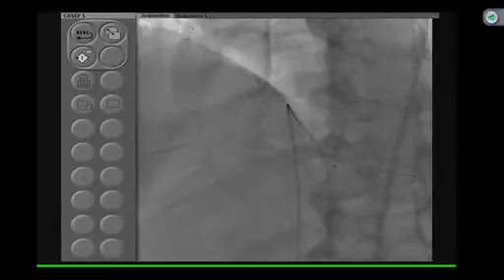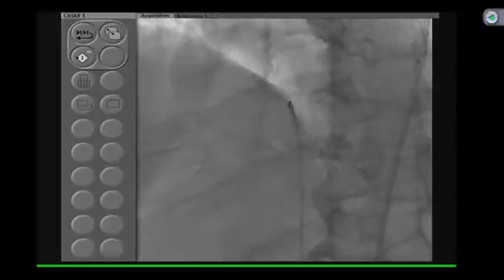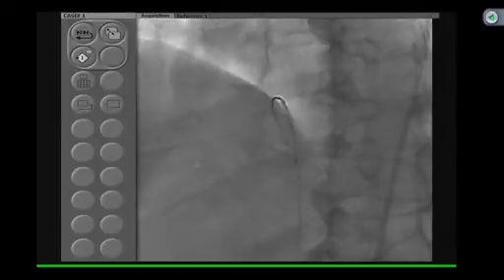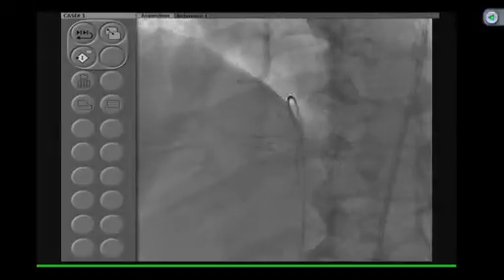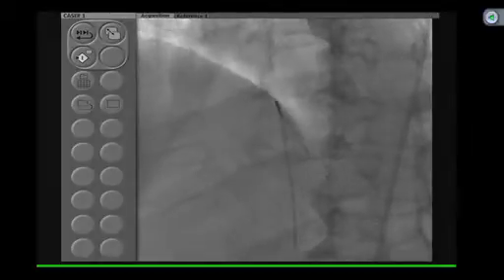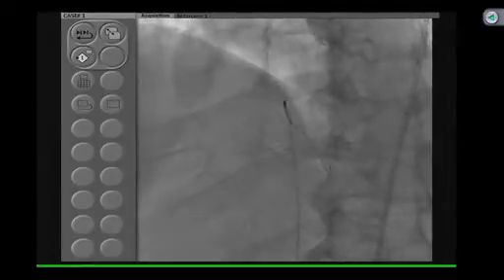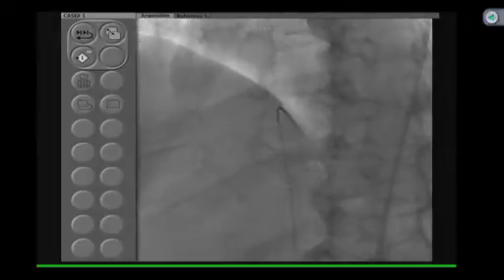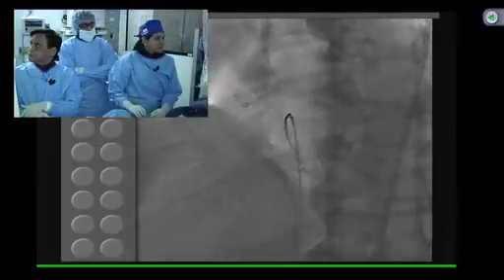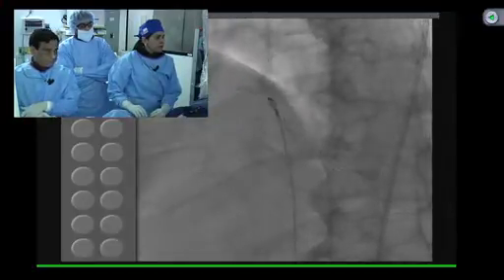Okay. Yes, okay, so what is happening is I am trying to wire at this distal bifurcation, the same thing. Very important is why important that you go with your workhorse wire, and more important whenever you are going through in-stent restenosis or bifurcation, better to have a fielder or any kind of a glide coated wire, so that you are in the true lumen and not going through stent struts and going back into the lumen through the stent strut. So, if you see here the way the wire is behaving, if you can see that it is not an easy pass at the level of the bifurcation. Probably needs a little more shape also. Yeah. So, in that situation is what your tactile feel is telling you, is the wire movement very easy or no.